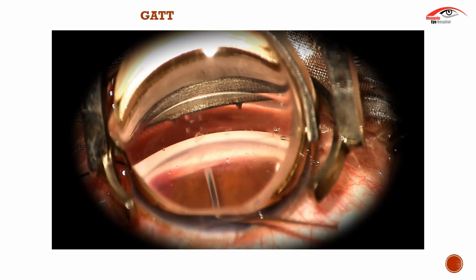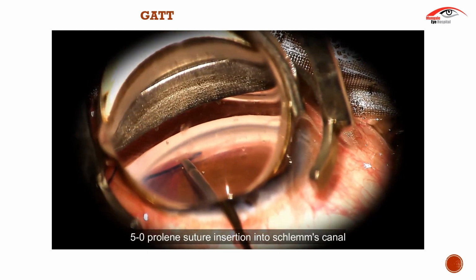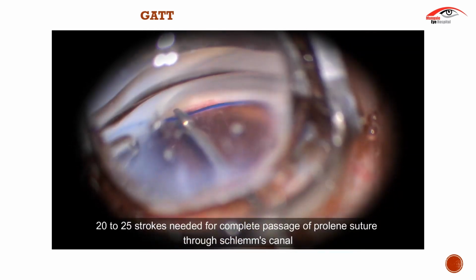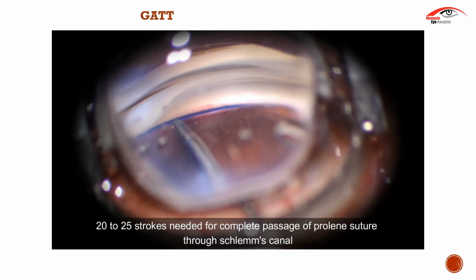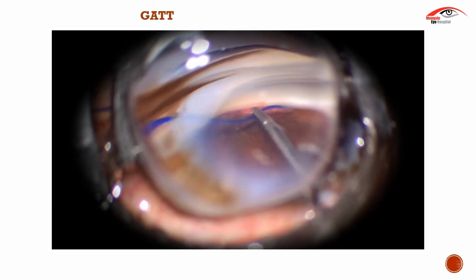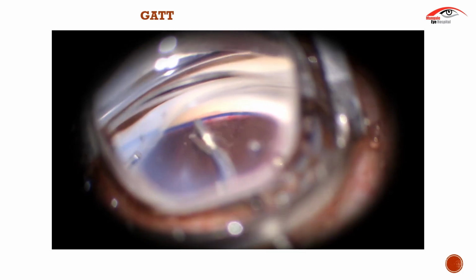With the help of a fine microforceps, the Prolene suture is passed through the Schlemm's canal with gentle strokes till the leading bulbous tip is visualized after traversing the 360 degrees of the Schlemm's canal. About 20 to 25 strokes are needed for the complete passage of the Schlemm's canal.